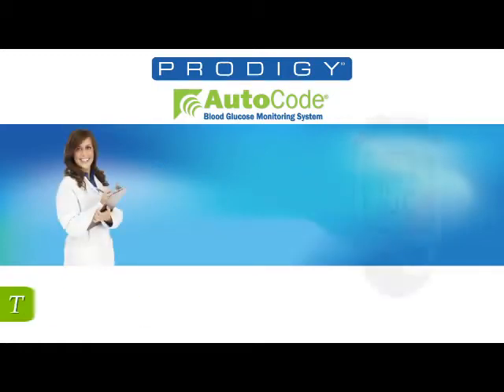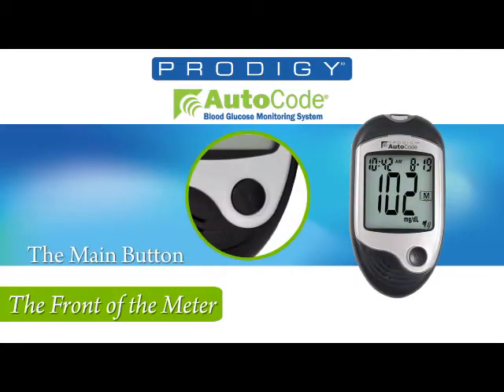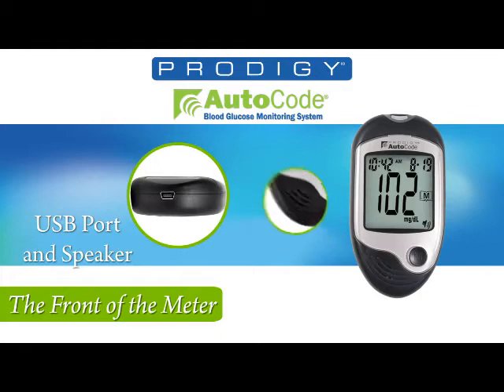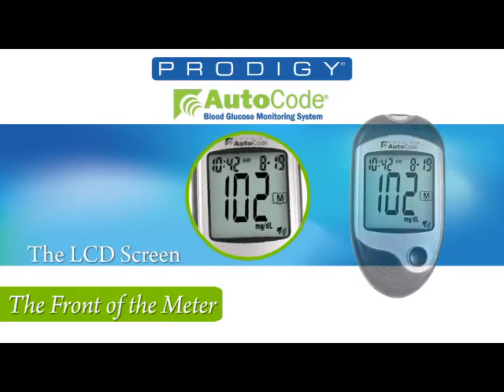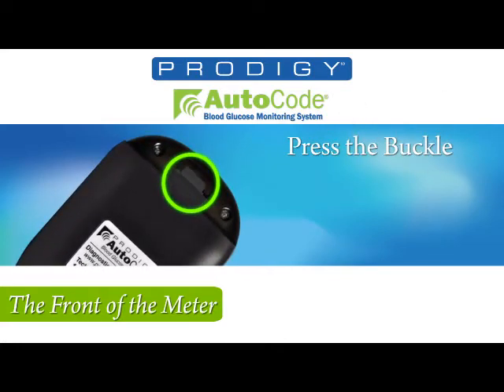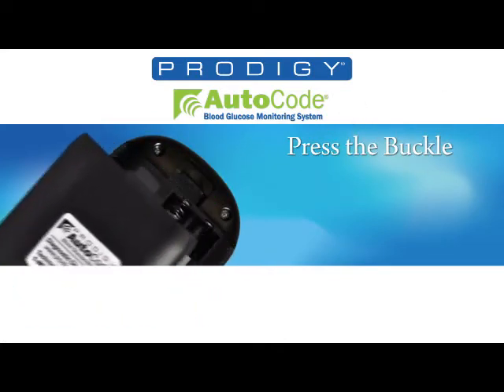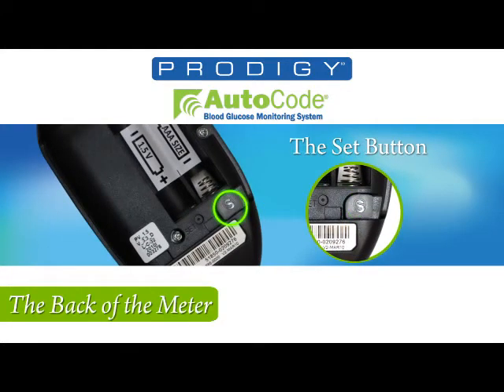Let's take a look at the front of the meter. Starting from the top, you'll see the test strip slot, then the M button. On the bottom of the meter is the USB port and the speaker. Finally, you will notice the LCD screen. Now looking on the back, you will find the buckle. By pressing down, you'll open to the battery compartment, and also see the set button you'll be using for setting the meter.